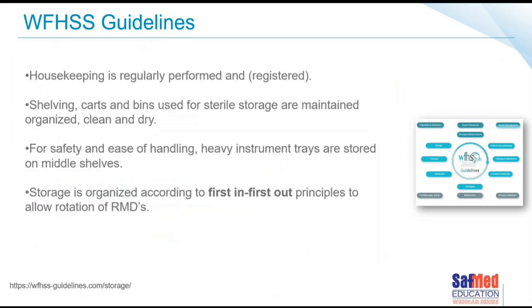Back to the WFHSS guidelines, and it reiterates what we've already said. Housekeeping should be regularly performed. They use the word registered. I guess that means recorded. Shelving, carts and bins used for sterile storage must be maintained, organized, clean, and dry. Very important. For safety and ease of handling, heavy instrument trays should be stored on the middle shelves. It does not make sense to store your heaviest items high up or low down.